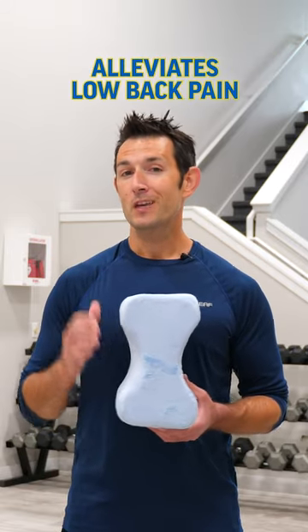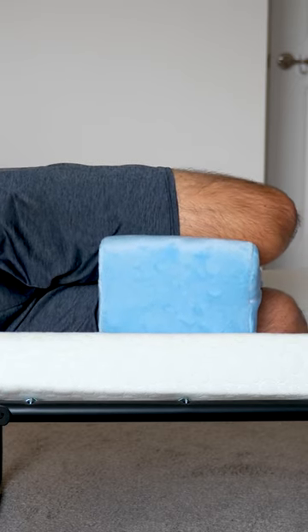The OPTP Contour Leg Pillow is a wonderful companion for a restful night's sleep, especially if you suffer from common forms of low back pain. The Contour Leg Pillow was designed to fit between the knees to help alleviate pressure and stress on the low back, knees, and ankles while sleeping on your side.